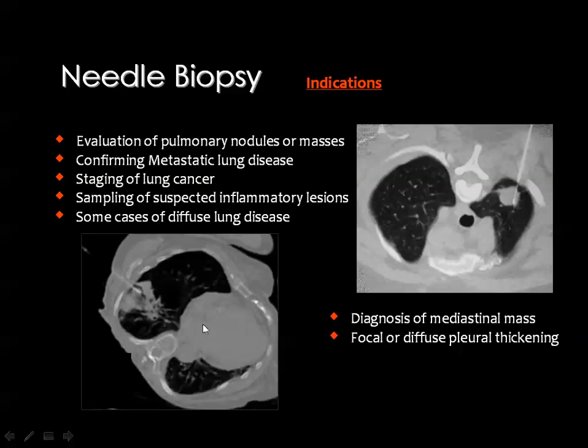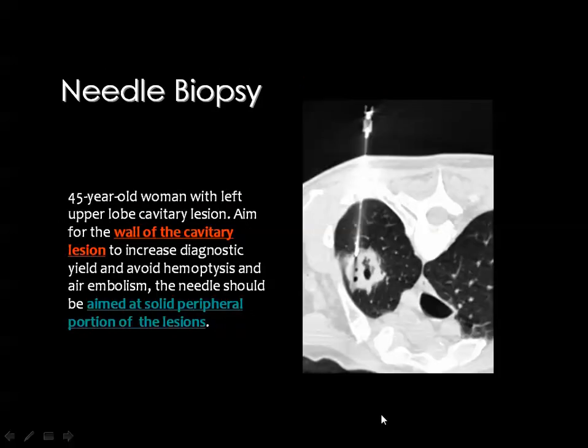And sometimes you may need to biopsy such a lesion, which is a patch in the lung showing air bronchogram, may represent the pneumonic patch, but whenever the patient is subjected for the possible treatment for pneumonia and the lesion did not resolve, or even is fulminating or progressing, then you should know the exact underlying pathology, and you may need sometimes to biopsy such a lesion.